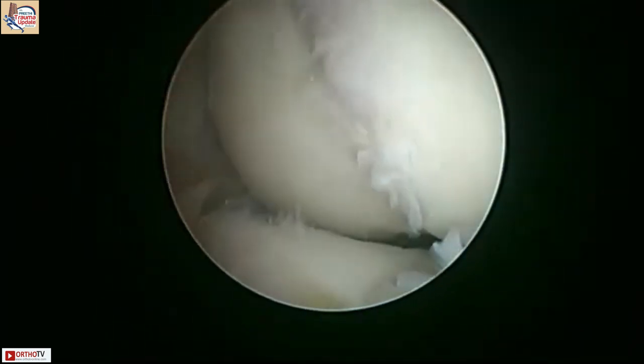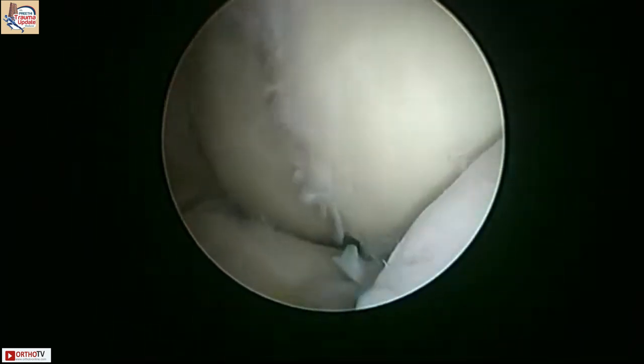Do you think removing the tip of the coronoid will improve the flexion? Do you plan to do that? Okay, so we'll just do that for me. Okay, you can see the coronoid? Yes, yes, we can see that.